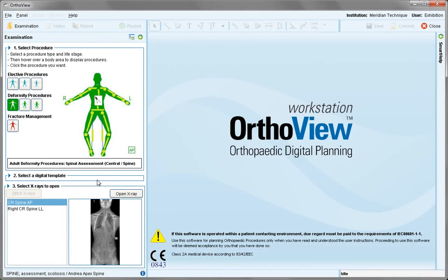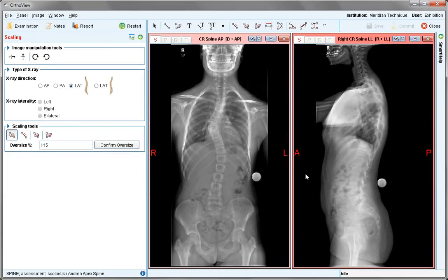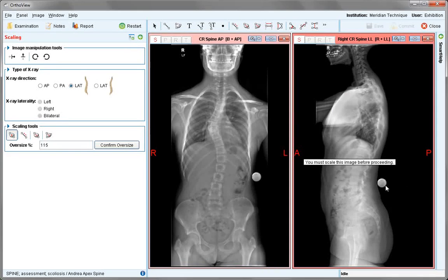No templates are selected for this assessment procedure. Choose the AP or lateral image — both just for demonstration purposes of scaling in this case — and open the x-rays. First the lateral image: it's necessary to match the shape of curvature of the spine to that shown in the view of the lateral spine.